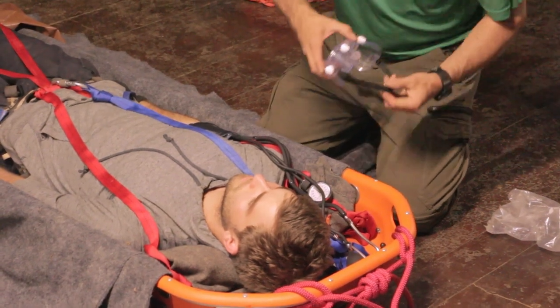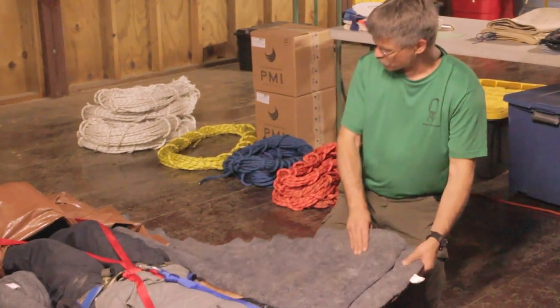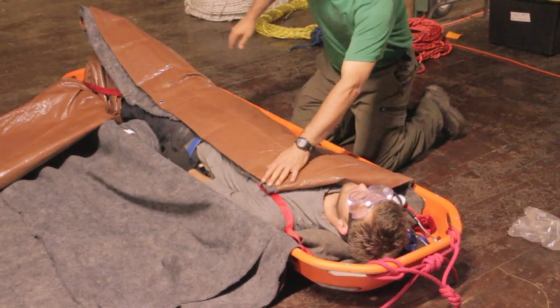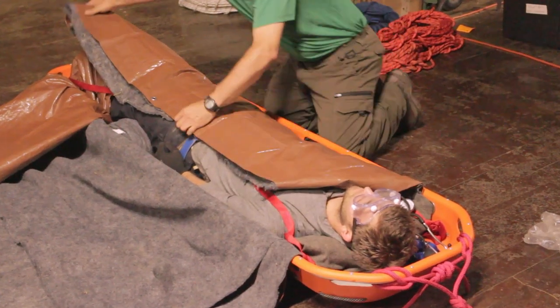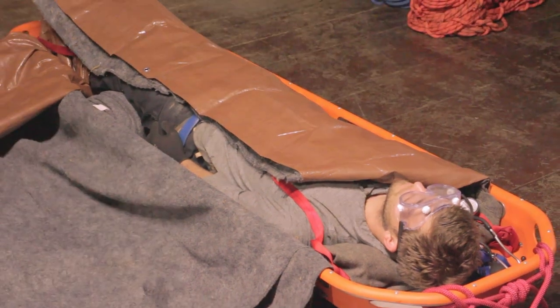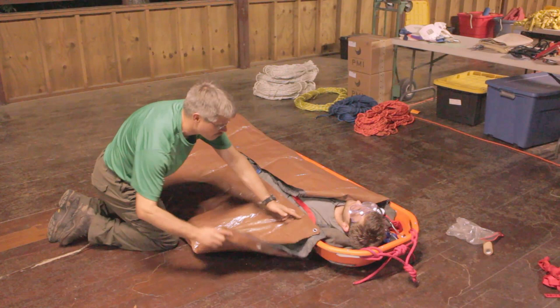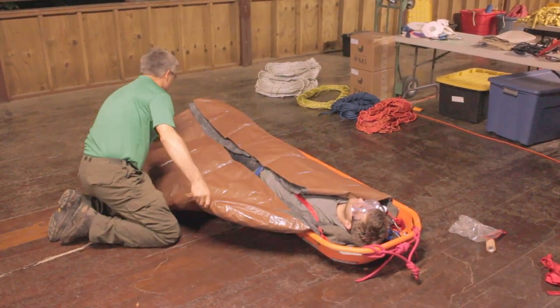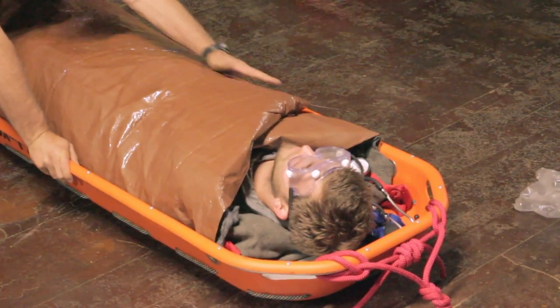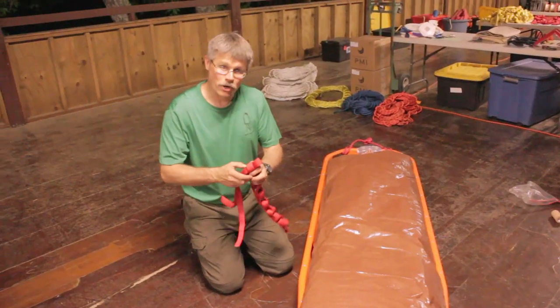I'm going to go ahead and put some goggles on Eric for eye protection. Now we're going to go ahead and finish our exterior packaging, starting on the short side — give it a little bit of a fold corner and very neatly wrap this up and over, wanting it to come just past the midriff. That gives us an ability to shed water and make sure that we're going to have a good shingled system when it's all done. I'm going to start by folding the entire thing in and making it shorter, then fold to the opposite side — we want this side to be long enough that any water coming on there would shed like a shingled roof, making sure no water can get into our patient, nice and smooth and even.